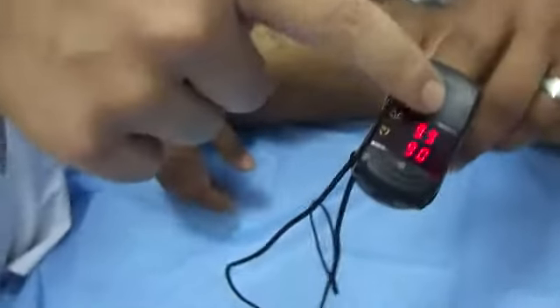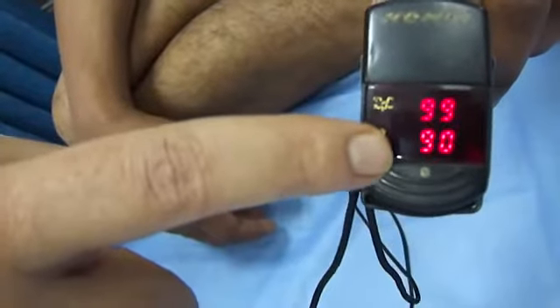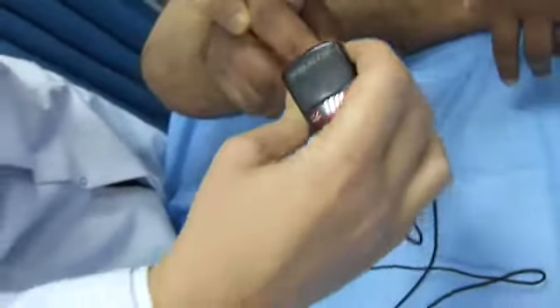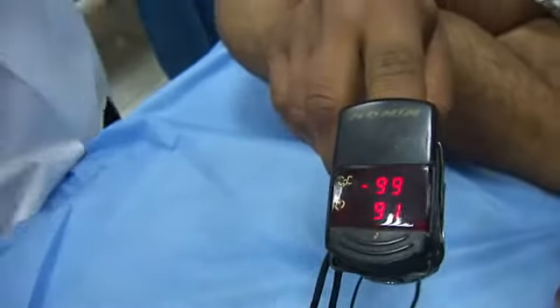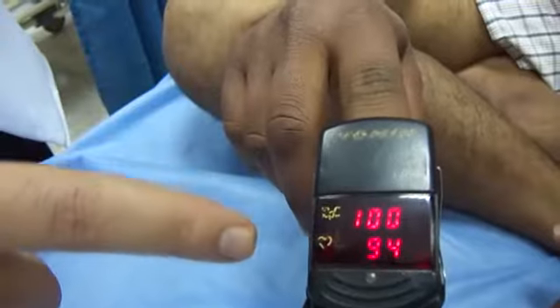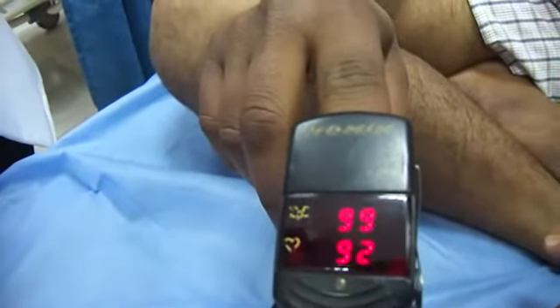This is the 99, and this is the pulse rate, which is 90. And then you have to check the contralateral side. Also, it is calculating now. It is also 99, and the pulse rate now is 92.